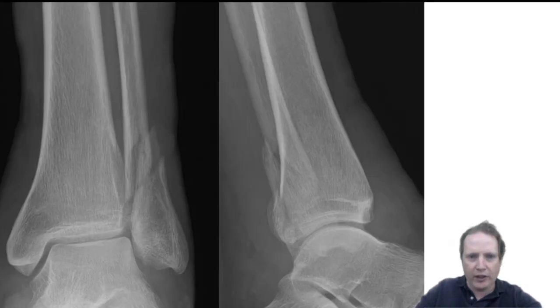So these are the radiographs. As you can see, it's an AP of an ankle showing a normal mortise with a shortened and rotated fibula. On the lateral radiograph, you can see a posterior malleolar fracture. It involves about 20% of the posterior aspect of the tibia. This is displaced, and for those who can notice, the talus is actually sitting posterior on this lateral radiograph.